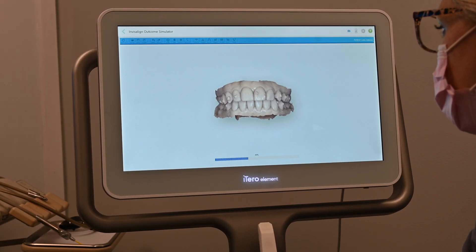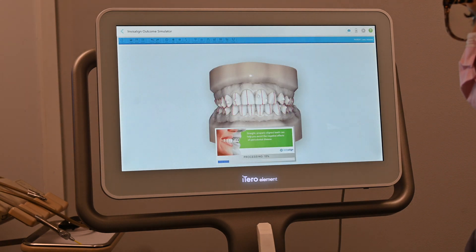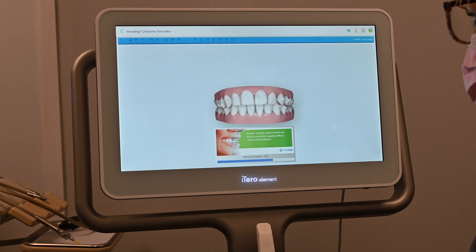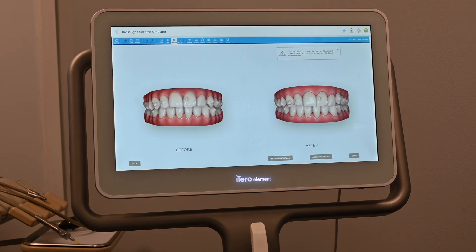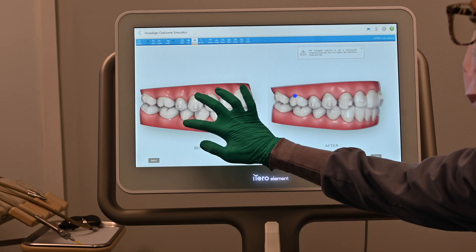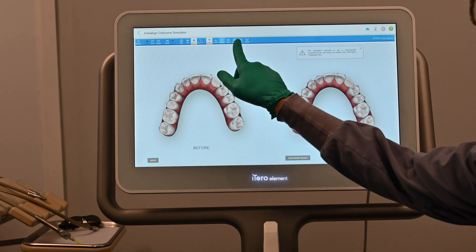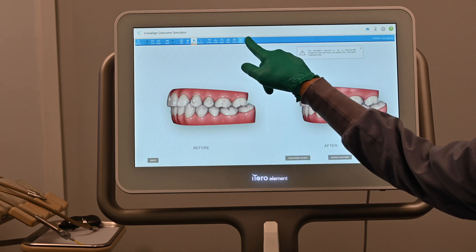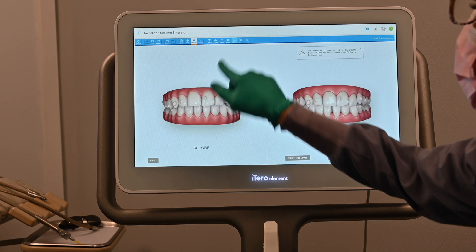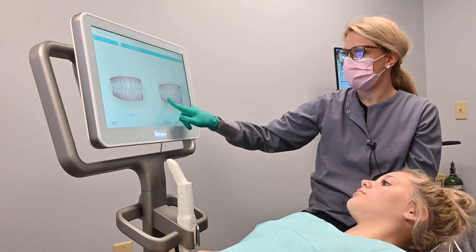You'll see here on the iTero that it is producing your models to show you your simulation. The iTero is going to show you before and after — you can see all sides of the mouth, both arches. Then what we'll do is directly submit to Invisalign through their site. They will take your models from the iTero and be able to produce your Invisalign trays for you.